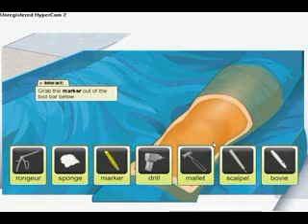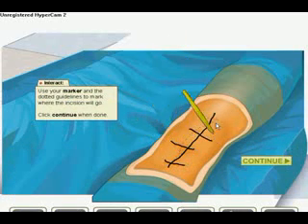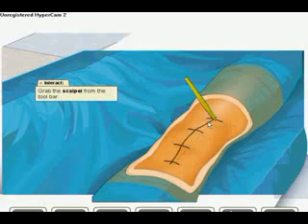Use the sterile marker to draw the location for our incision, and don't forget to mark the perpendicular lines too. Typically, the incision line. What purpose do you think the perpendicular lines serve? Outstanding. Now for the incision.